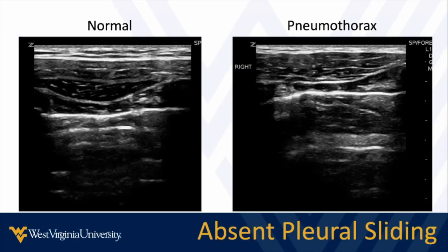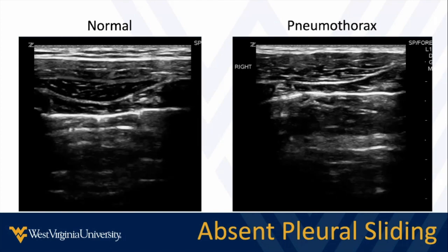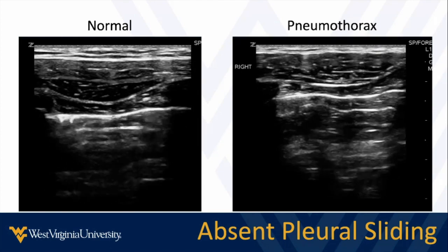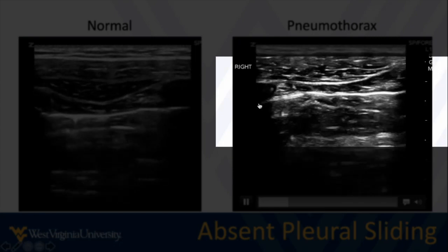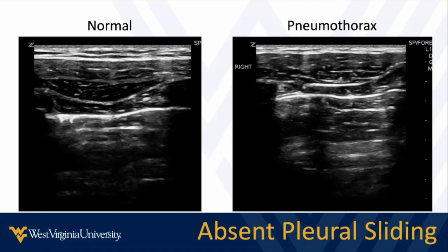Do we see pneumothorax? This one is pretty straightforward, and this can help us distinguish between spontaneous pneumothorax versus maybe auto PEEP in the patient who's decompensating on the ventilator. So here we see lung sliding, pretty intact underneath the ribs, rib shadows here. Here we've got ribs. We can see movement in the chest, but we see no lung sliding at all. So this patient likely has pneumothorax.